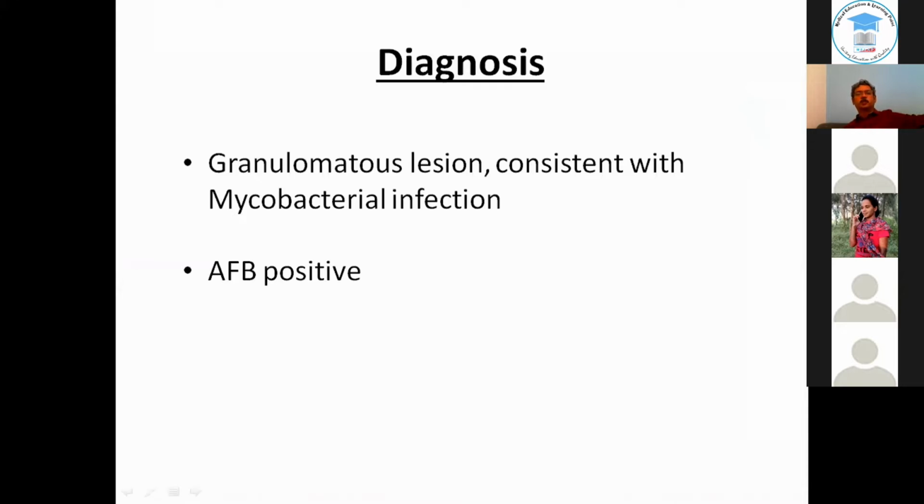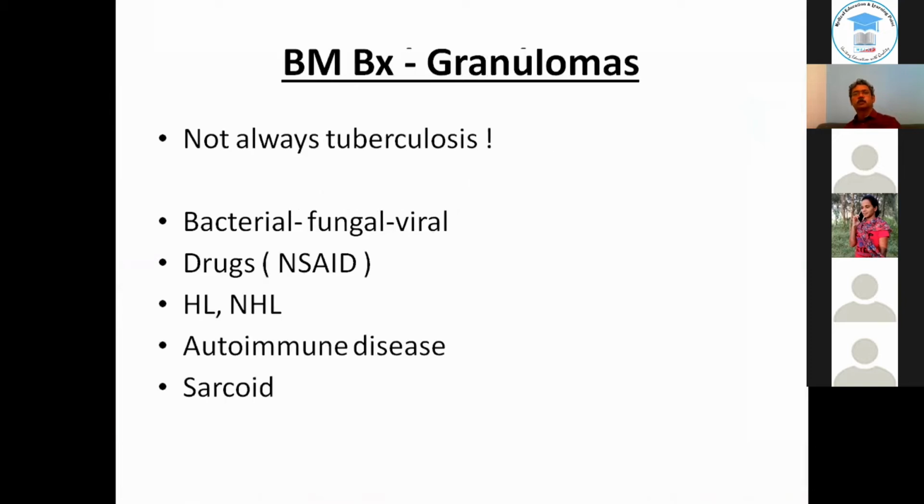This was AFB positive, though I didn't get the AFB image out here. This was AFB positive, so we call it tuberculosis. But do remember that in a bone marrow biopsy or anywhere else, a granuloma does not always mean tuberculosis. There are multiple causes for having granulomas.